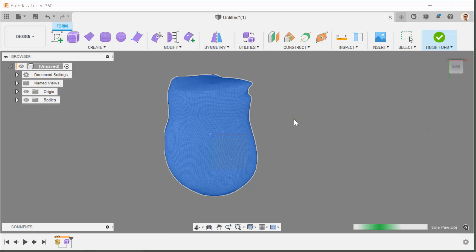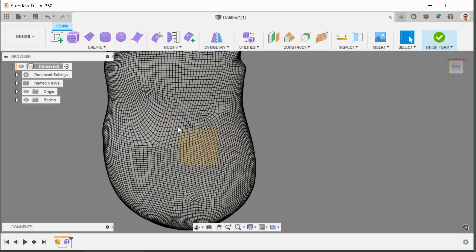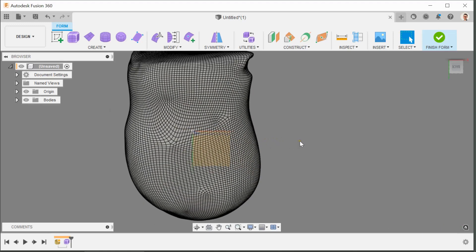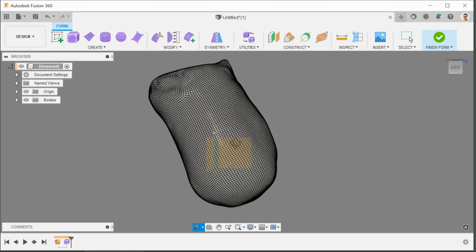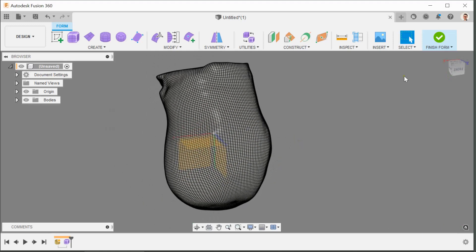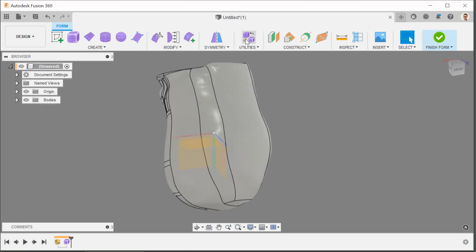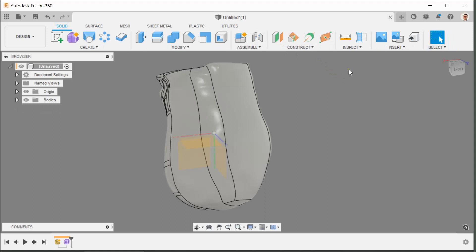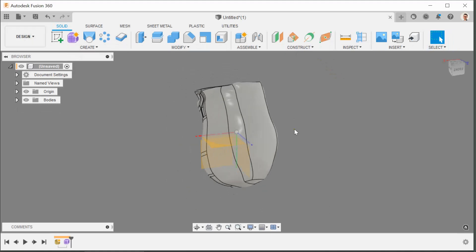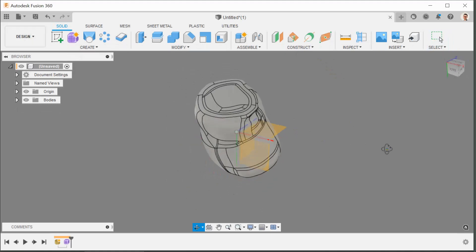But there's another final step which is to finish the form. When we click finish form now that will take us out of the create space, all the menu will change, we're back in the design workspace.